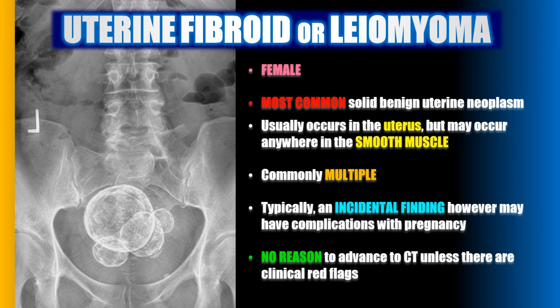Uterine fibroids or leiomyomas are found in females — they're the most common solid benign uterine neoplasm. They usually occur in the uterus but can occur anywhere that has smooth muscle, and when they do occur they're usually multiple rather than solitary. While they may look alarming, typically the radiographic finding is incidental, unless the patient is younger and trying to get pregnant. Advanced imaging such as CT is generally not needed unless there are clinical red flags.